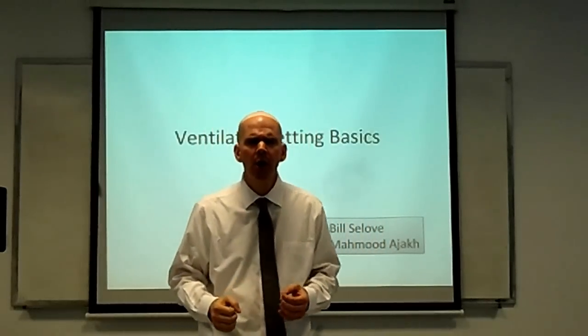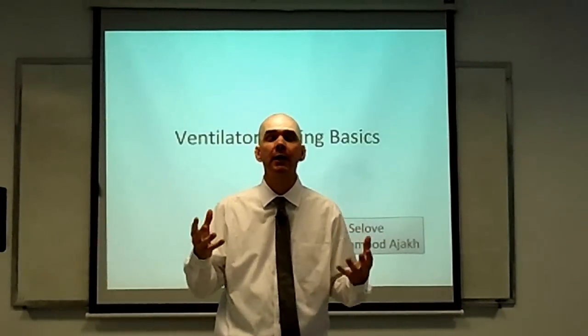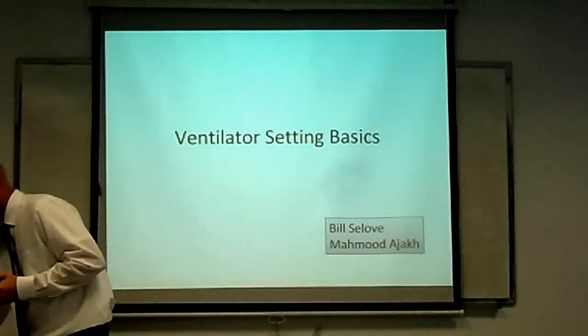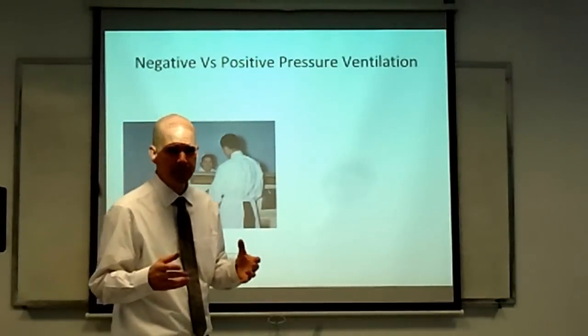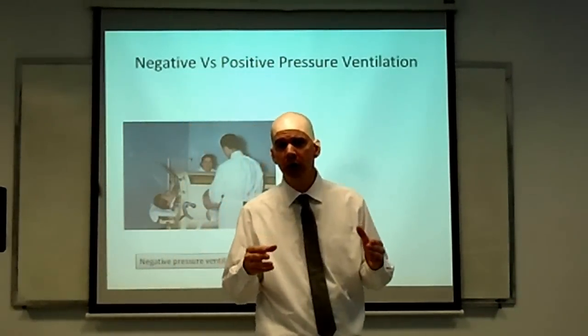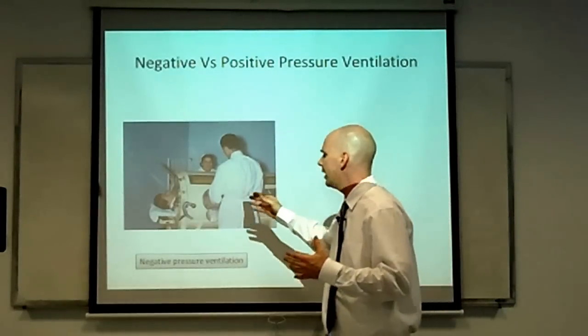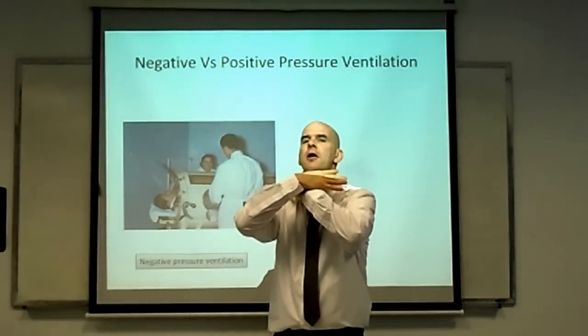of ventilators. Before we get into all that, though, I think it would be helpful to talk about what mechanical ventilation is. It used to be that when you would talk about mechanical ventilation, you would mean negative pressure ventilation. Back in the 1950s, when polio was epidemic, patients would climb into these big machines called iron lungs. It would basically cover them up completely from their neck down.